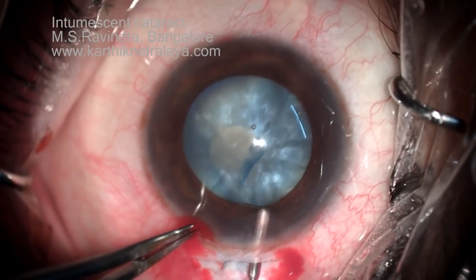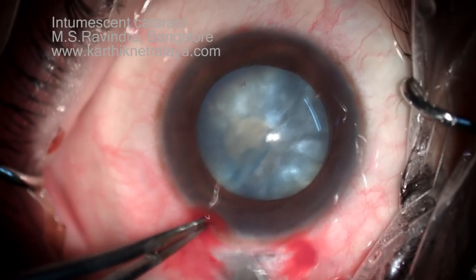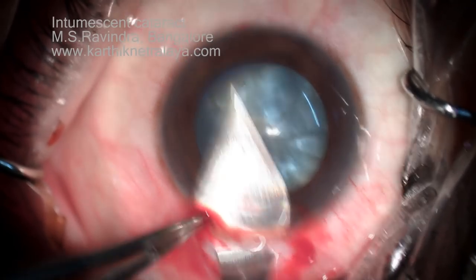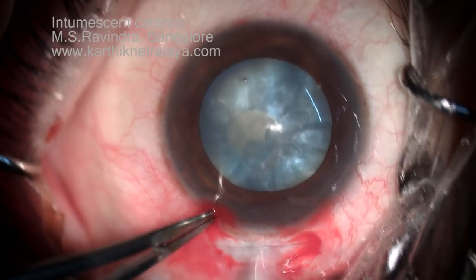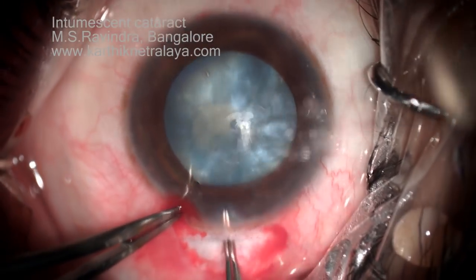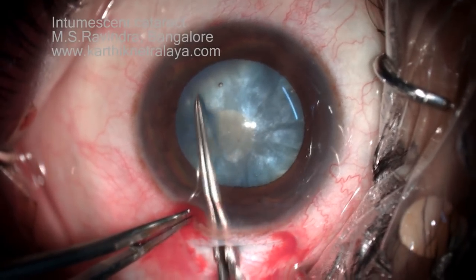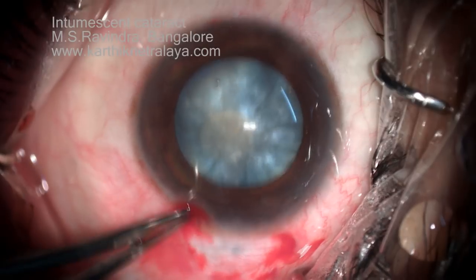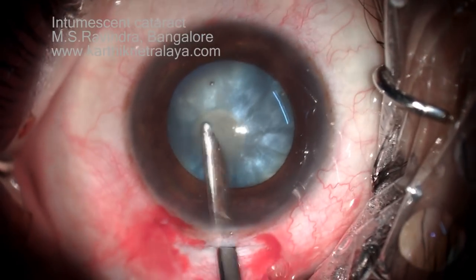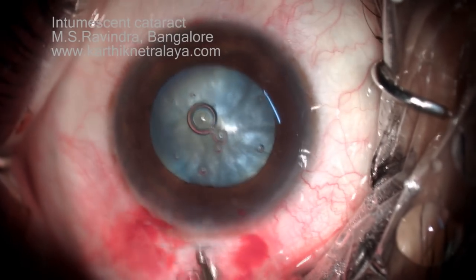A few drops of lignocaine are injected into the anterior chamber at this stage, as is done in topical anesthesia. The internal opening is enlarged from 3 to about 6.5 millimeters. Now Utrata forceps are used to carefully bring the rhexis back and complete the circuit. It's a very small rhexis and now it won't run off to the periphery because of the intact rhexis margins.